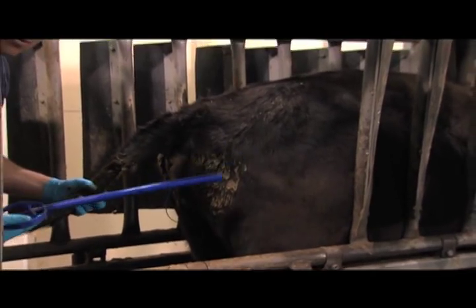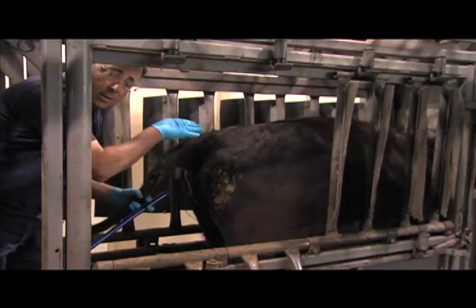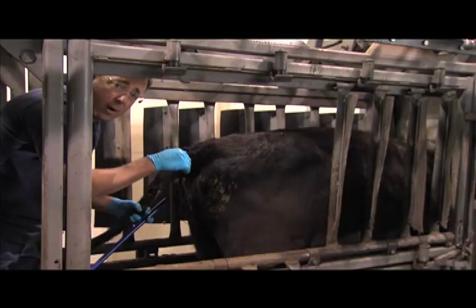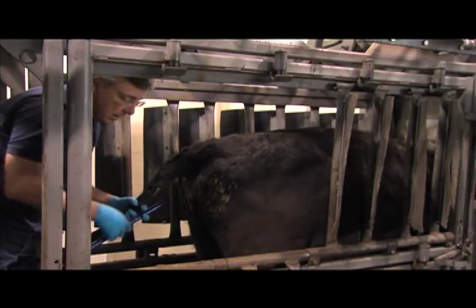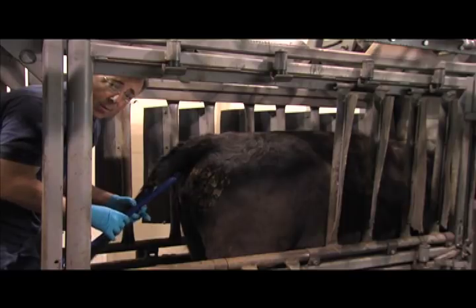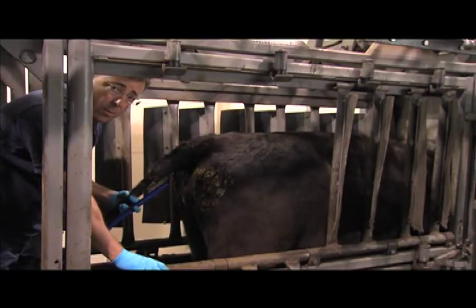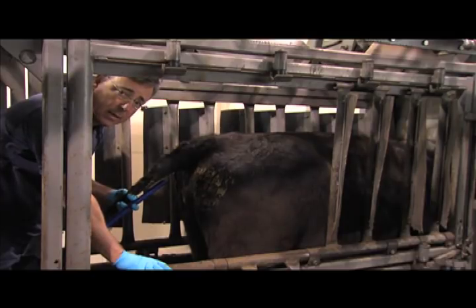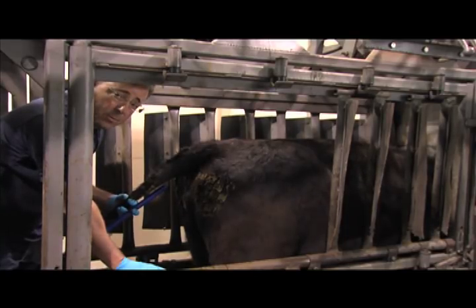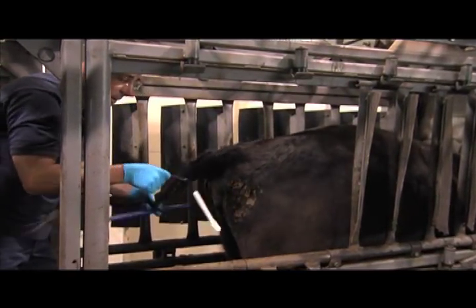The only difficulty in inserting the cedar device is about three inches or so into the vagina, where the suburethral diverticulum is — that's where the urethra empties into the reproductive tract. That creates a ridge, and sometimes you have to gently manipulate the cedar device up over that ridge so that you can deposit the cedar into the anterior vagina. The body fluids soak up the hormone, and as long as the cedar device is in the animal's body, she will not be able to come into estrus. When you're ready for the animal to come into estrus, simply grab the string and remove the cedar device.